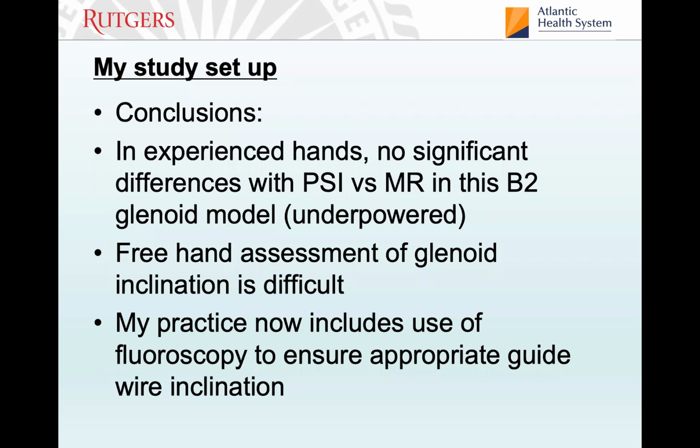The supraspinatus fossa is almost always about 5 degrees tilted or close to it. That's approximately what we say. So you can use that to see if you can match it to your pre-op plan, your pre-op guide. That's helped, I think, improve accuracy.